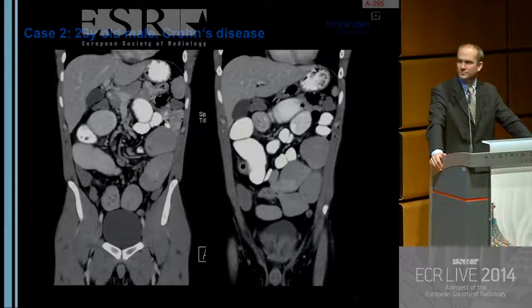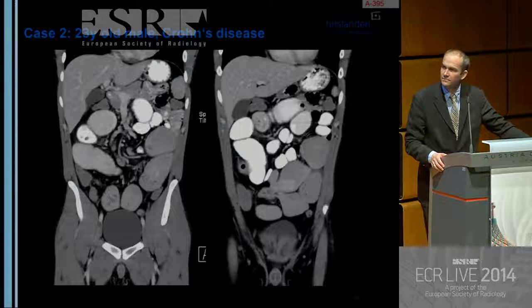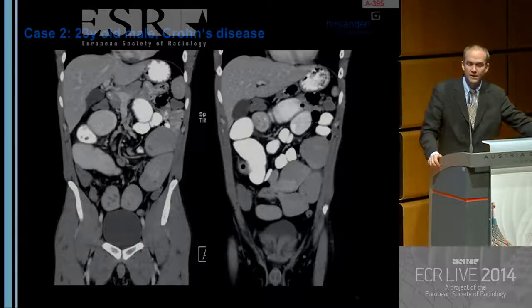Okay, so while you're answering that, can I ask you a quick question? If you had a patient with ileocolonic Crohn's, you know they've got ileal disease and they've got disease in their colon, and they come back with a flare so that they're feeling unwell, and your gastroenterologist wants you to do an MR scan, what protocol would you use? Would you just use an oral contrast load and hope it gets through to the colon, or would you specifically set up a protocol where you gave the rectal enema as well as a small bowel drink?